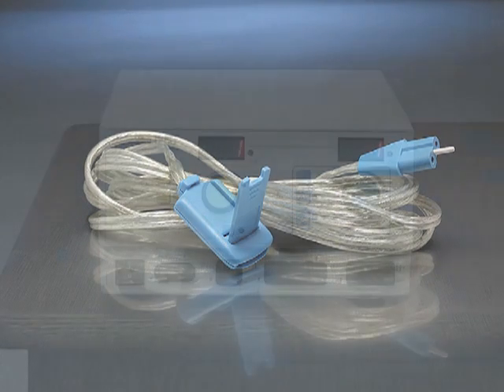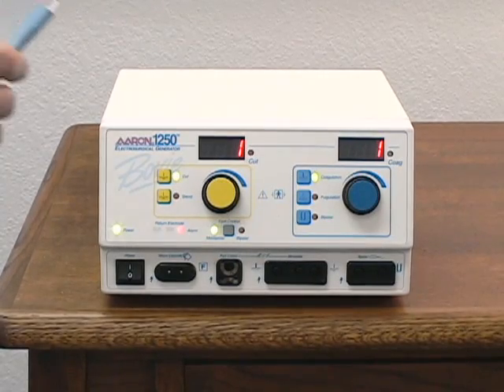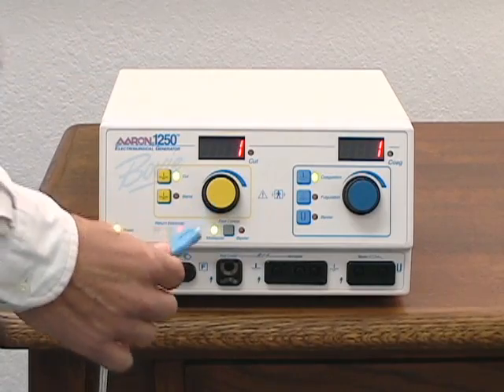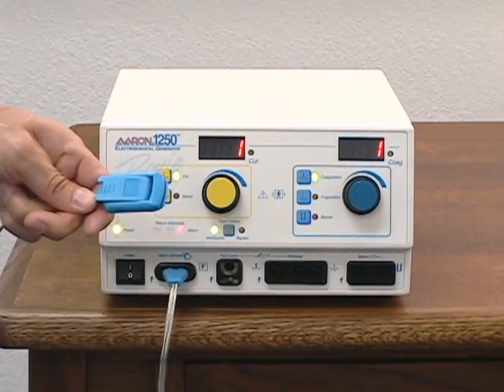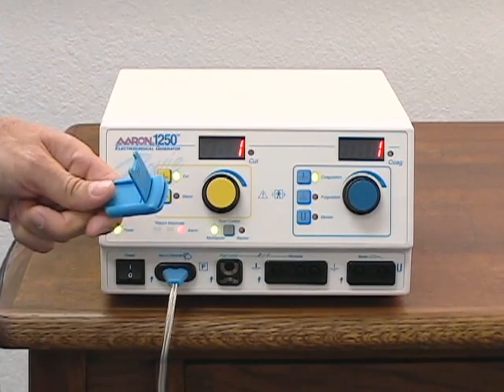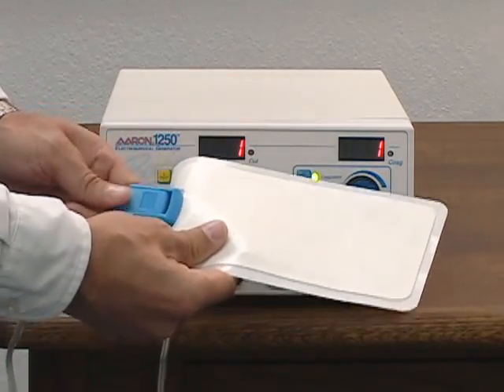The Aaron 1250 is packaged with a reusable grounding cable and five disposable split pads. To install the cable, insert the plug into the receptacle marked return electrode. To attach the pad to the cable, open the locking mechanism, insert the tab into the clip, and close the locking mechanism.